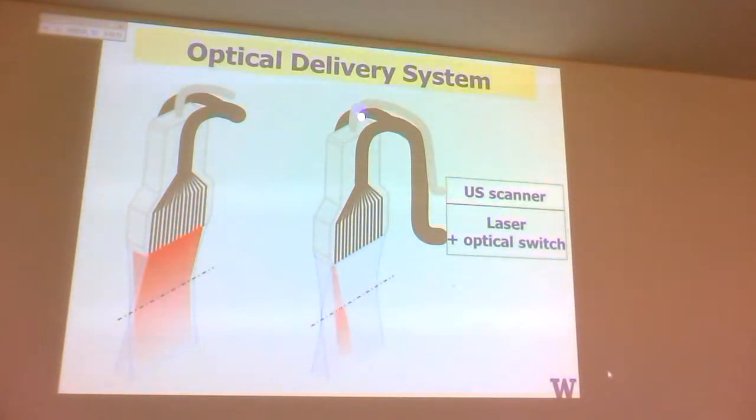It will be integrated into the cabling system that comes back, and then there's a split out in the scanner itself, and then you have a laser optical switching system which can switch between these at rates anywhere from hertz up to tens of kilohertz. So we can match our switching speeds going through these fibers to the laser rep rate.